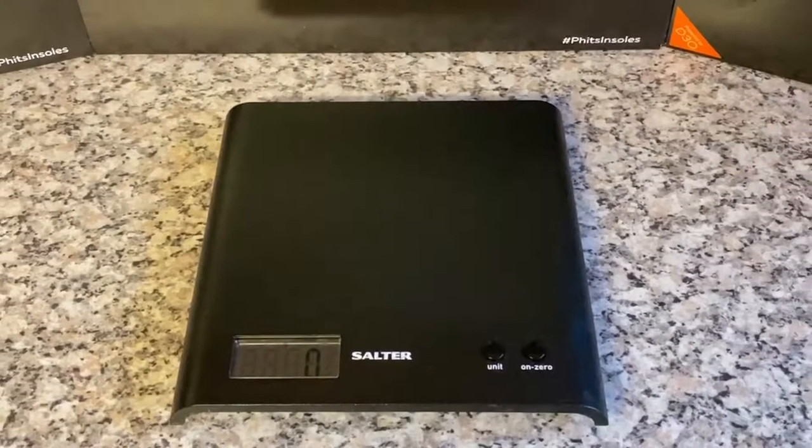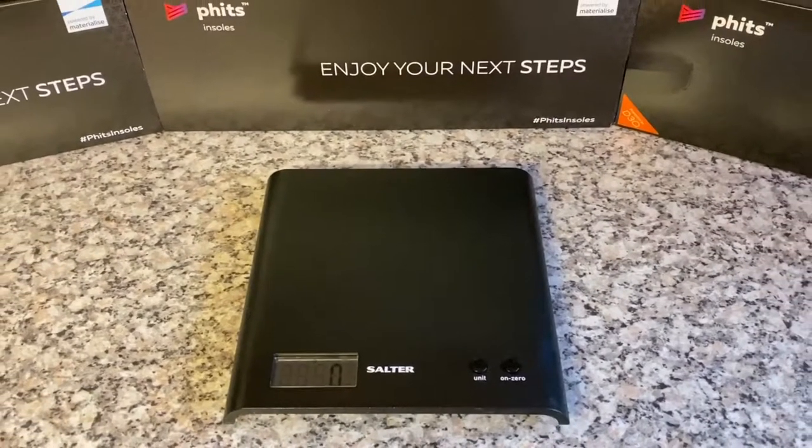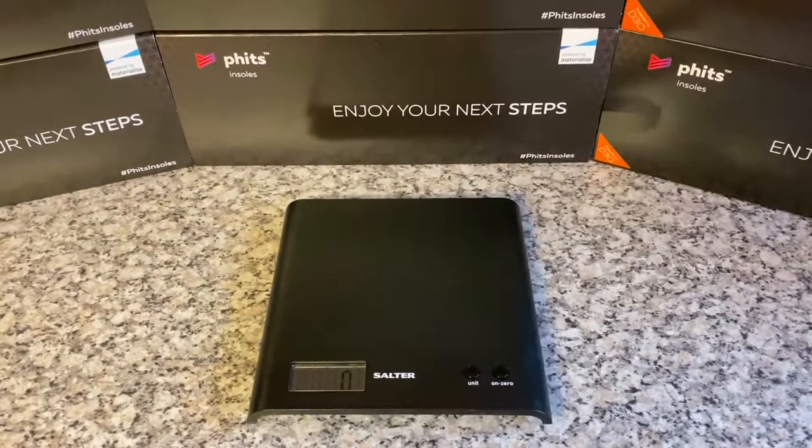People are often amazed by how light our Phits 3D printed insoles are, but how light are they? Let's compare versus a range of household objects.